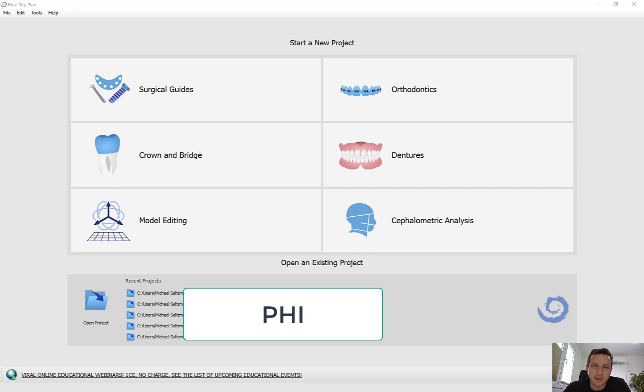Hello everyone, this is Michael Saltzman. I'm the Director of Digital Products at BlueSkyBio. I wanted to make this video to demonstrate the updated process flow for creating a conventional crown in the latest version of BlueSkyPlan, version 4.7.52.